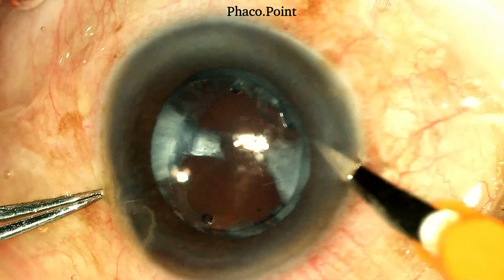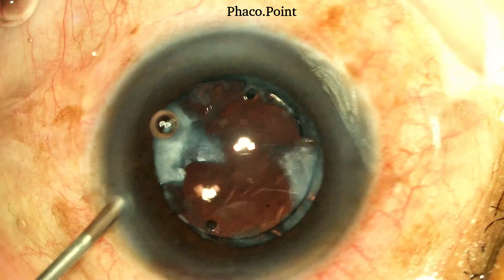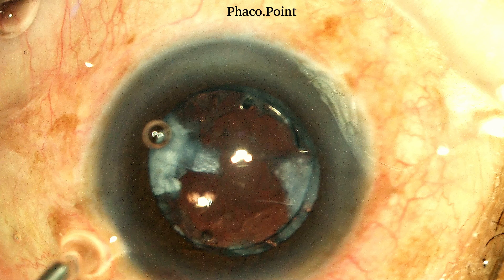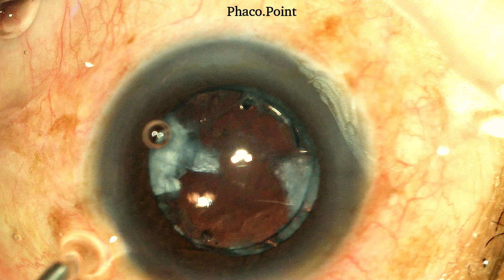I then introduce some viscoelastic into the anterior chamber to maintain space as well as coat the endothelium to protect it from damage.